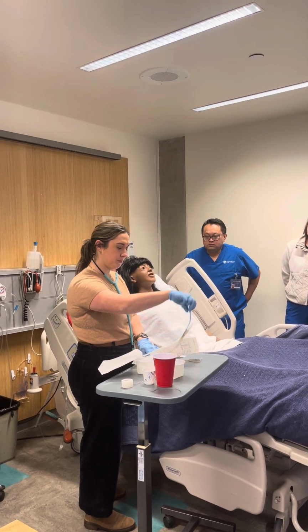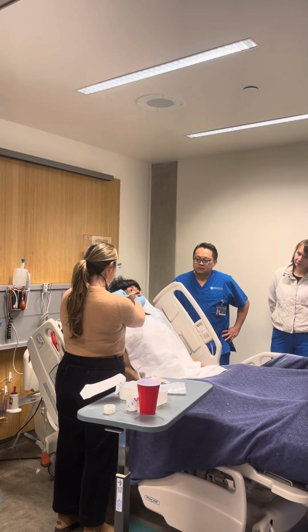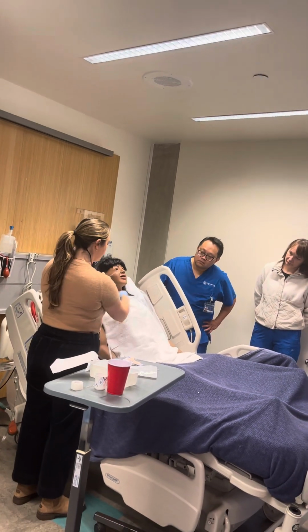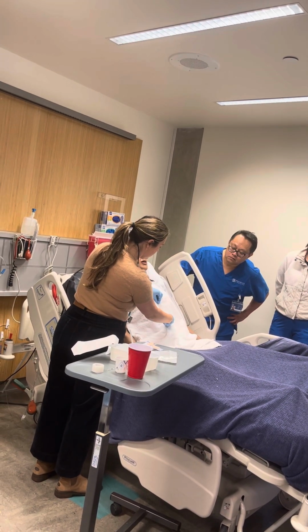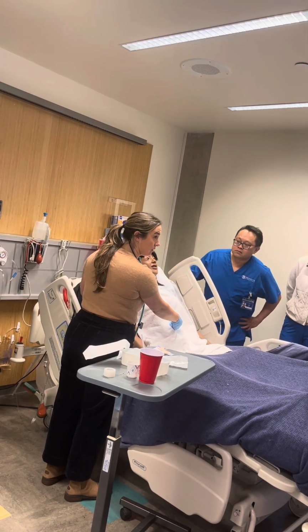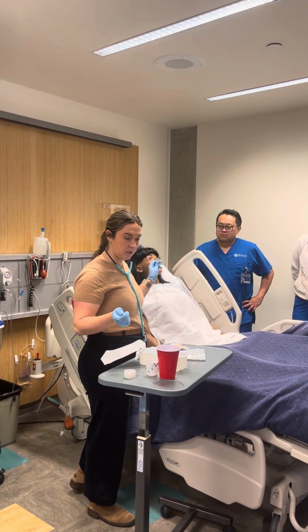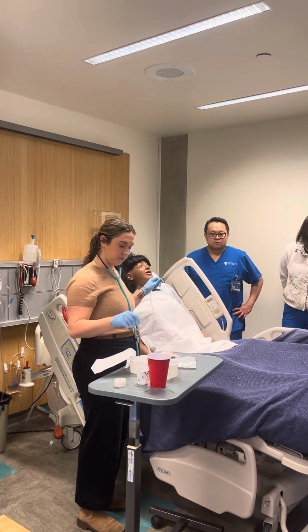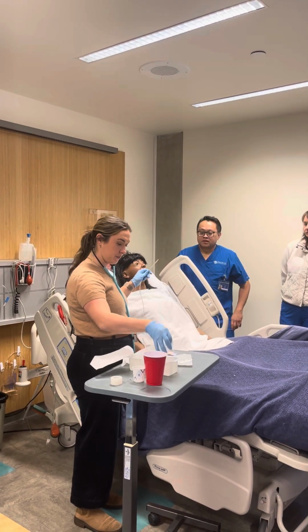I'm going to measure Miss Tran, nasal to ear, ear to xiphoid. That's at 50, then I'm going to add 10, so I'm going to go to 60. Okay, so now, I don't have any lubricant, can you throw me a mineral oil? Yeah. Now I'm going to prep this.